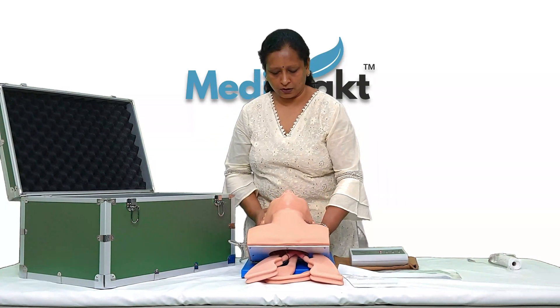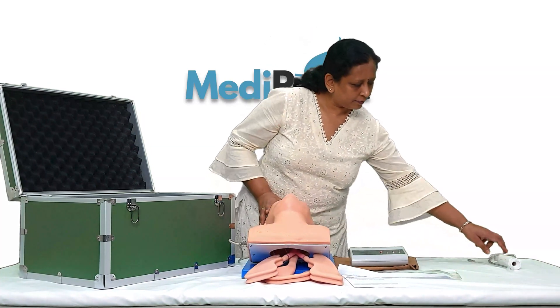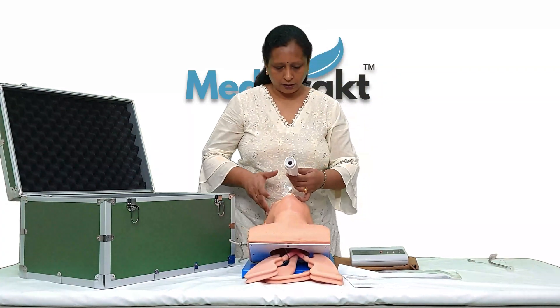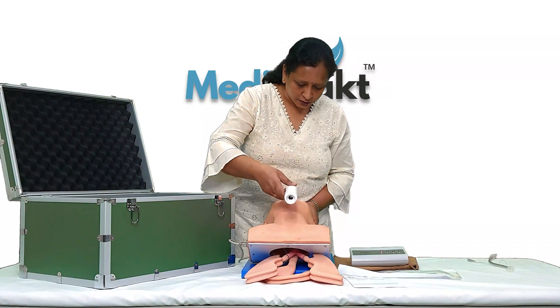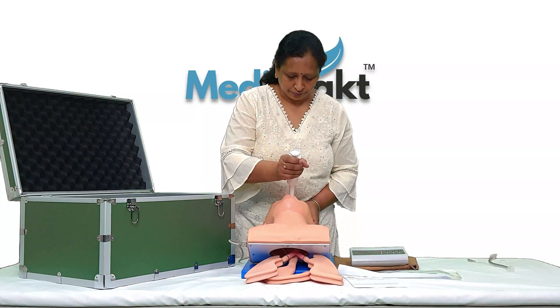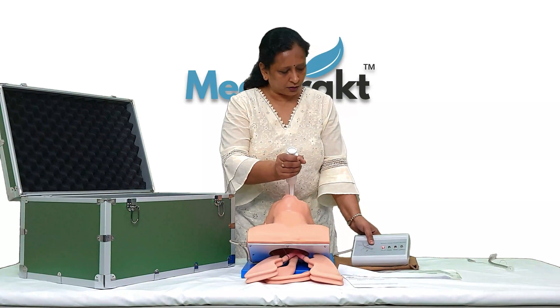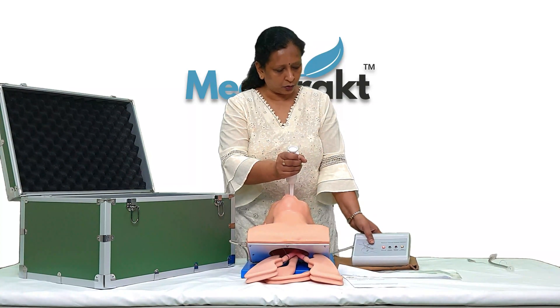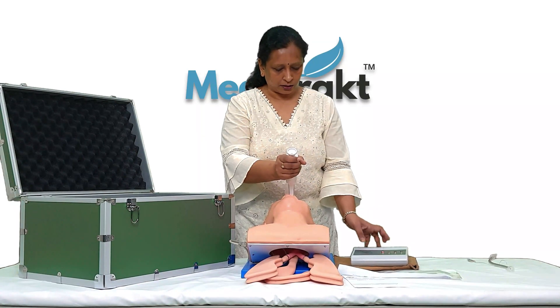This laryngoscope is not a part of the mannequin — it's just for demonstration. This indicator is showing that I am giving too much compression on the teeth, so we need to take care of this.